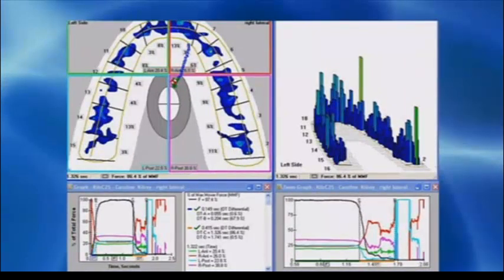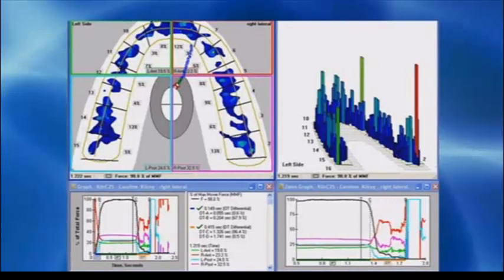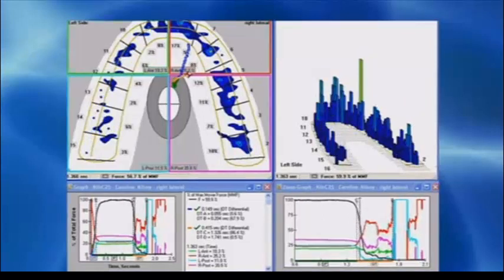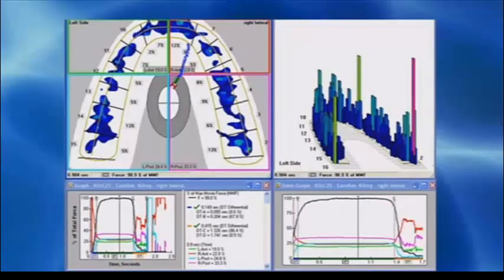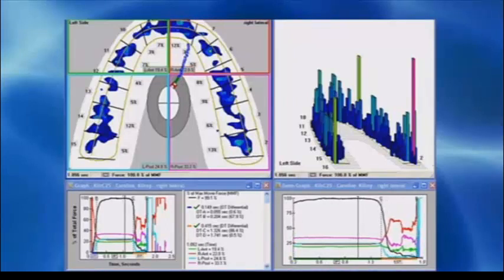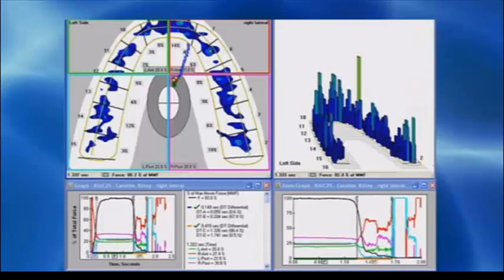So the front teeth I have to lessen a shade. The COF, the center of force, starts a little too far forward and it kind of moves outward and then moves backwards, and that indicates anterior pressure. And then in one of the movements, to the right, I believe, we have a little bit too much tooth contact when you move to the right on the left side, which has been a battle with you to try to get those last few teeth to separate.